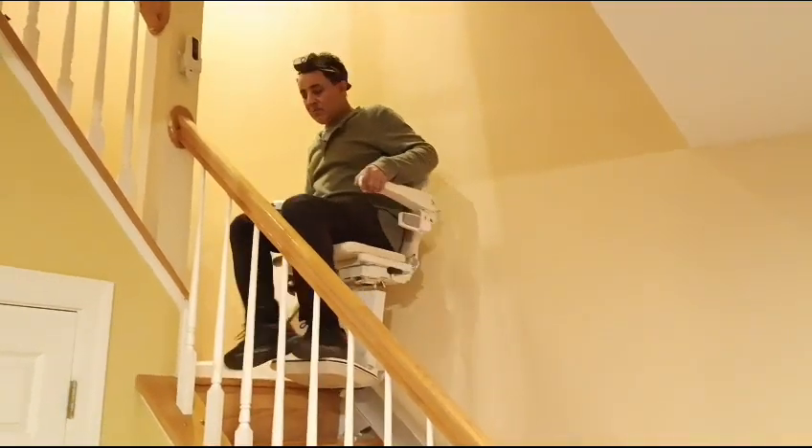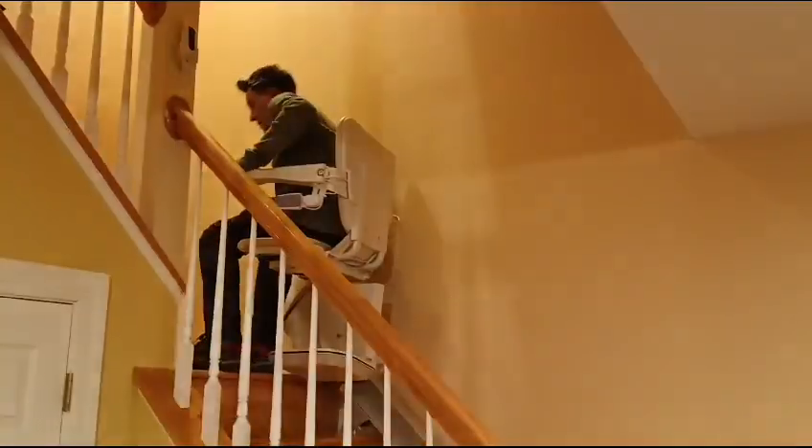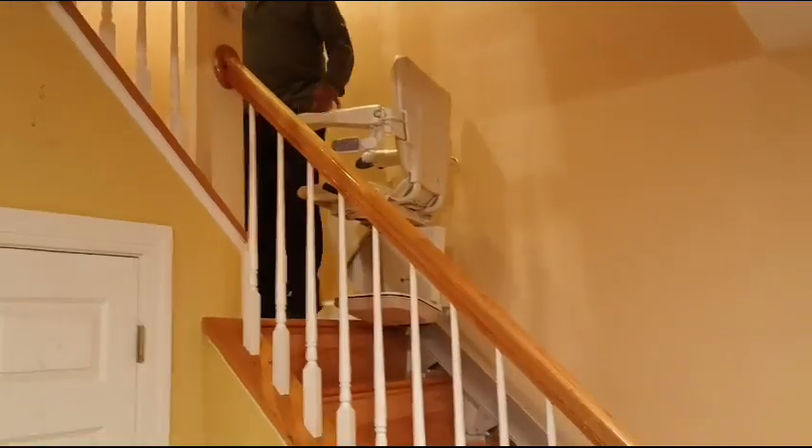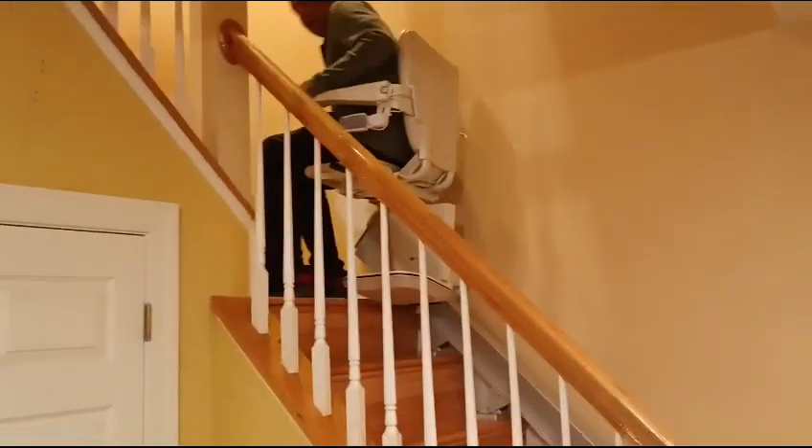Should I turn it? Yeah. And then that's how you turn. And when you turn, make sure it's locked in. Like right now, show them how it's locked. Yeah, it's locked in. So make sure you're in the locked position.